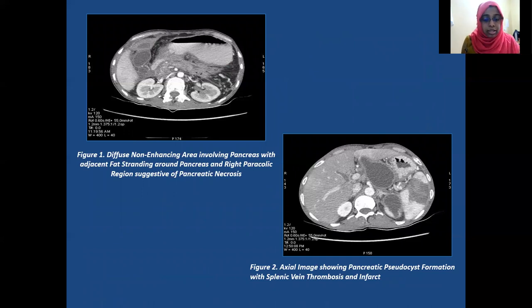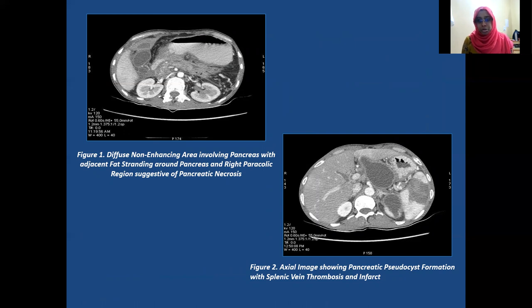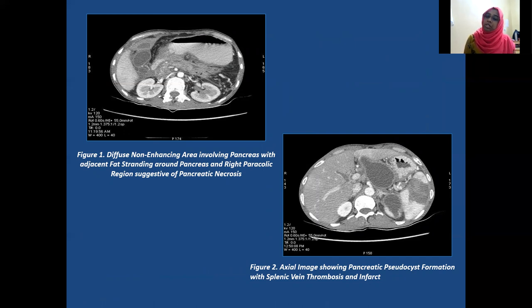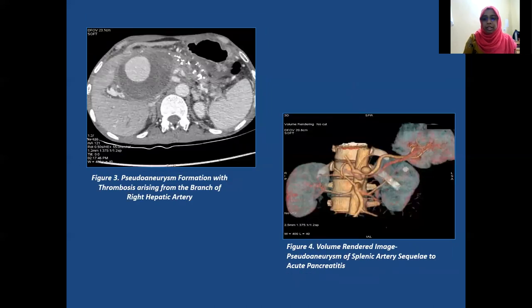In Figure 1, we can appreciate a diffuse non-enhancing area involving the pancreas, as well as peripancreatic fat stranding and fat stranding in the right paracolic gutter, suggesting pancreatic necrosis. In Figure 2, there is a well-defined fluid collection with thin margins in the lesser sac region in a patient with pancreatitis — this represents pseudocyst formation in the lesser sac. We can also appreciate a hypodense wedge-shaped area in the spleen, suggestive of splenic infarct due to splenic vein thrombosis.